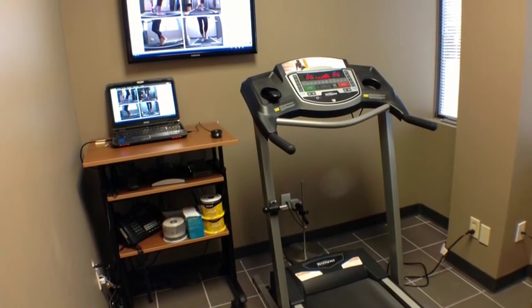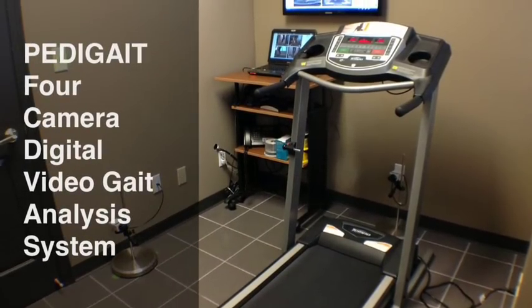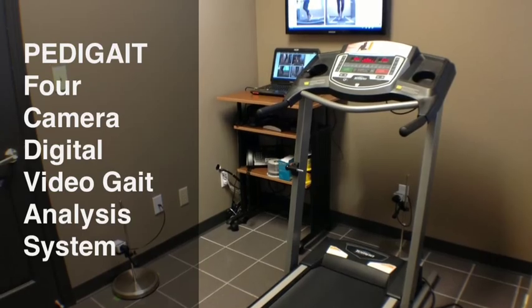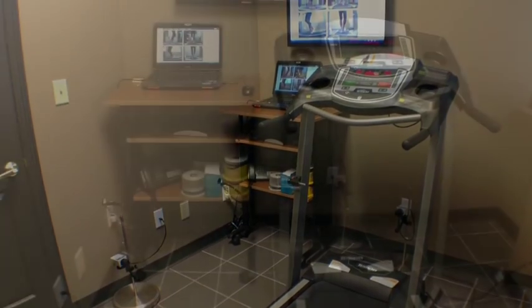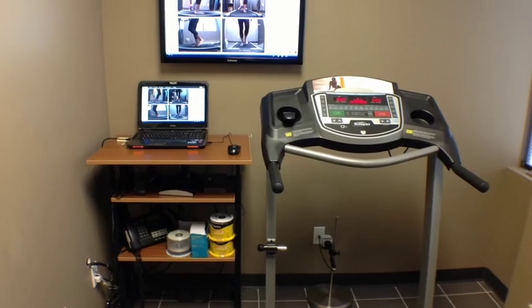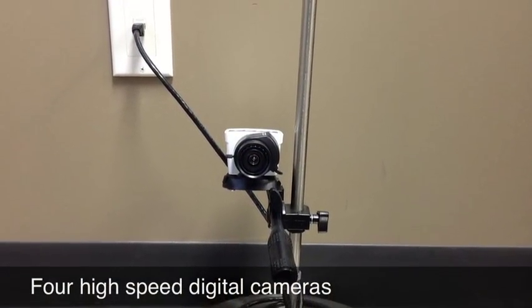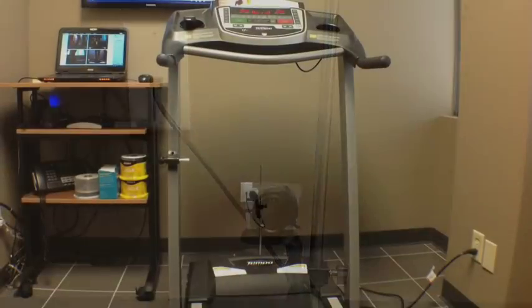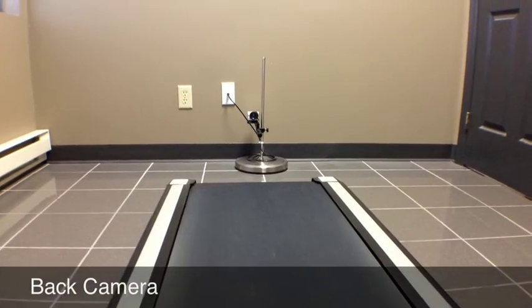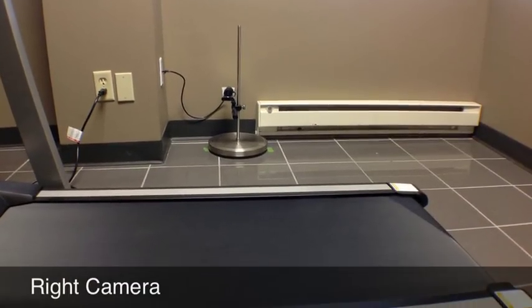With this in mind, we decided to take gait analysis to the next level. We purchased and installed a Pedigate 4 Camera Digital Video Gait Analysis System in our office. Our patients now either walk or run on a treadmill and are video recorded using 4 high-speed digital cameras capturing them simultaneously from the front, the back, the left side, and the right side.